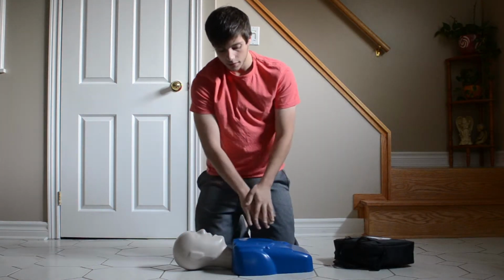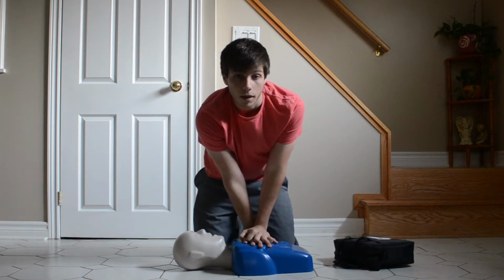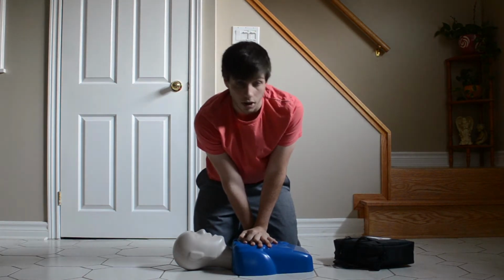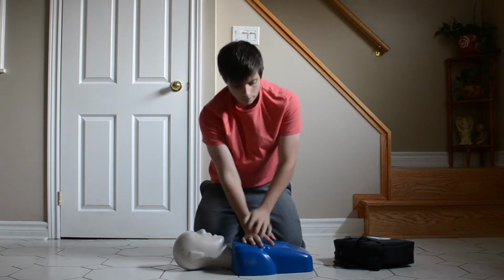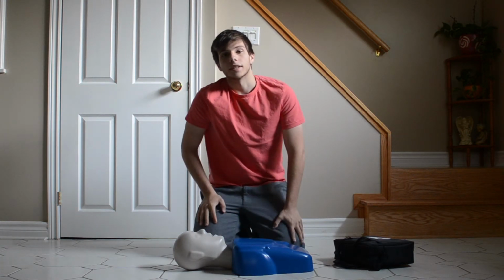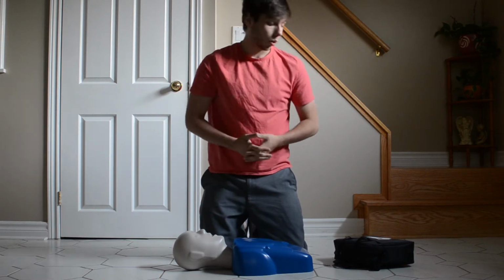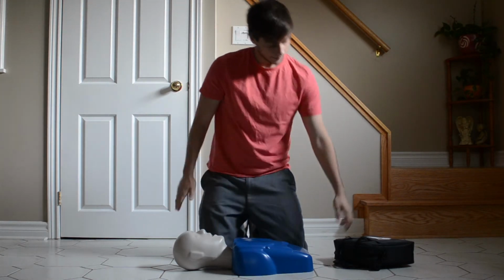Okay, 2 breaths are delivered, and then I want to start compressions again. So, 30 compressions, then another 2 breaths. 30 compressions, another 2 breaths. As I continue this cycling, I'm basically waiting for 911 EMS to come, or I'm waiting for an AED.